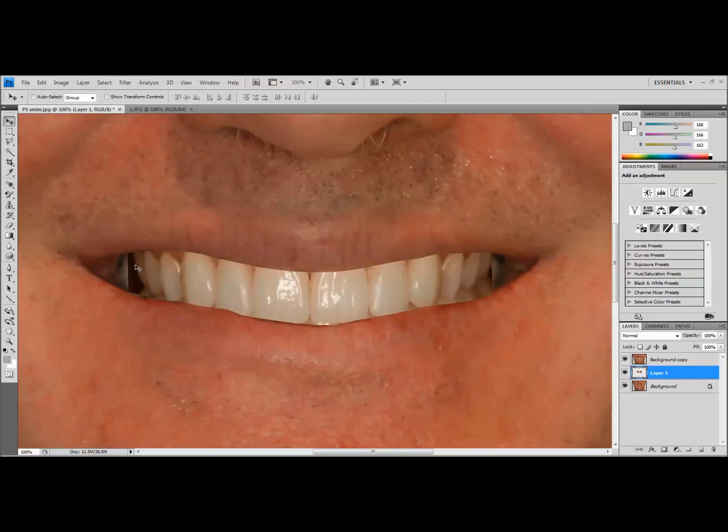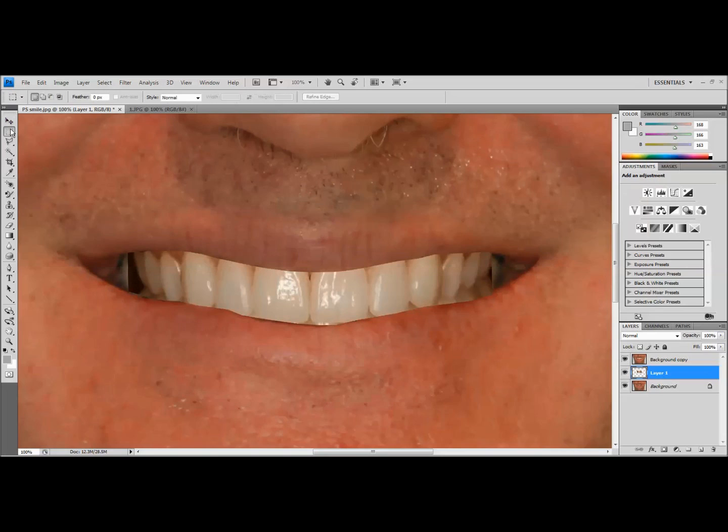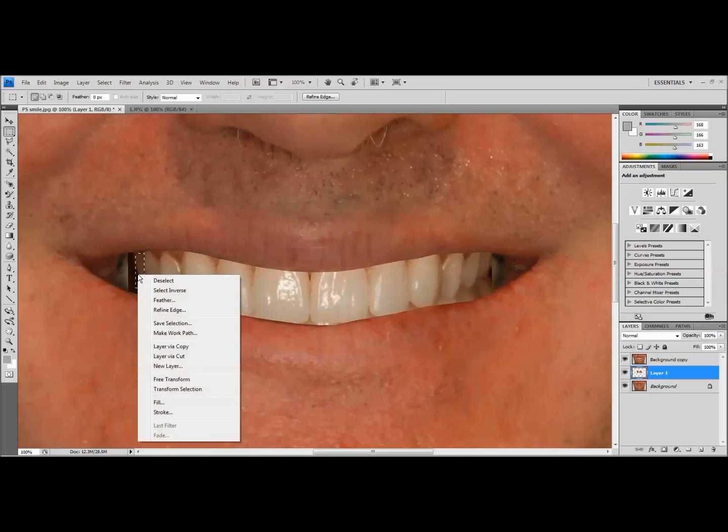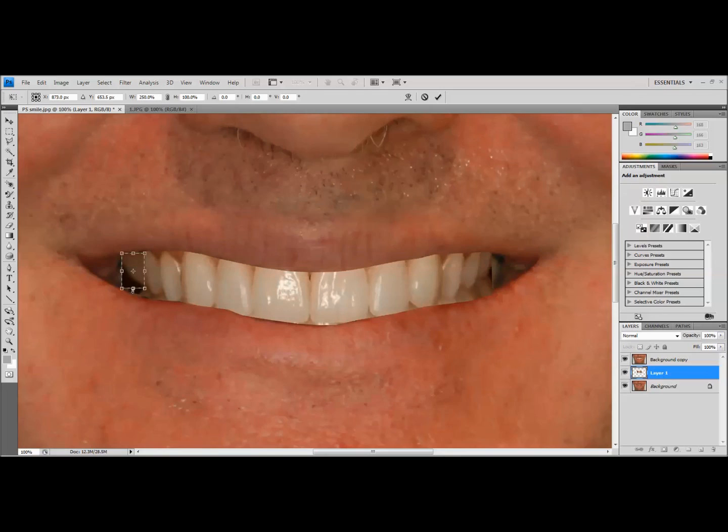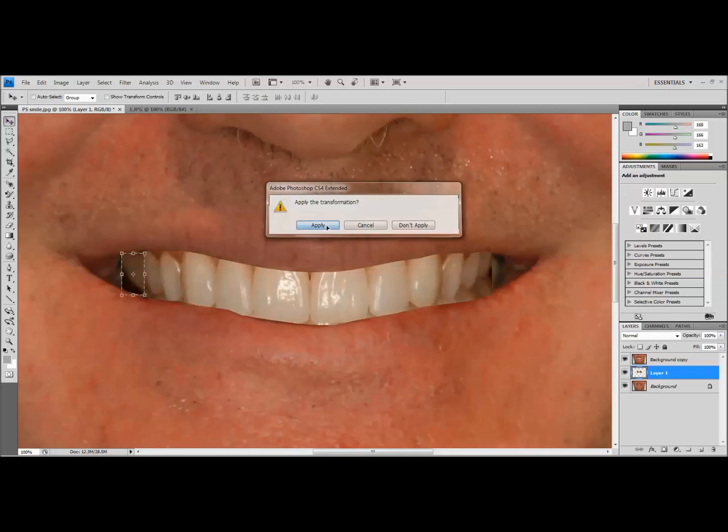Now, again, this looks narrower and you can actually see the patient's first molar out on this side, so one of the ways I'll modify that is I'm going to come in and get the rectangular marquee tool. And I'm going to just highlight the first molar and then we're going to right click, free transform that selection. Now I can widen out that first molar in our simulation. If I want to bring it down, I can do that as well. We'll apply it.